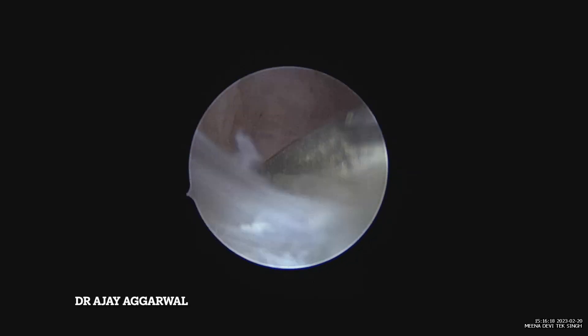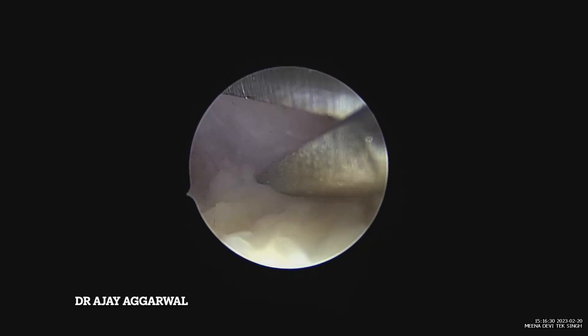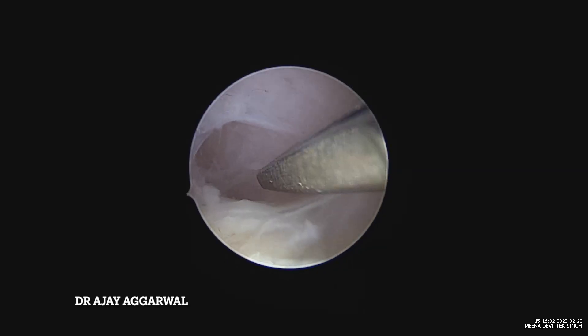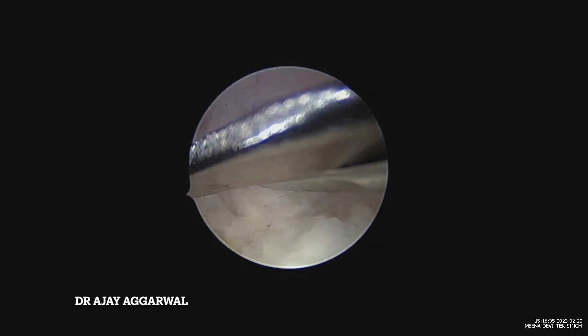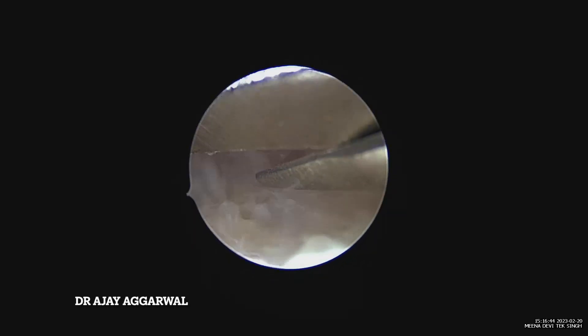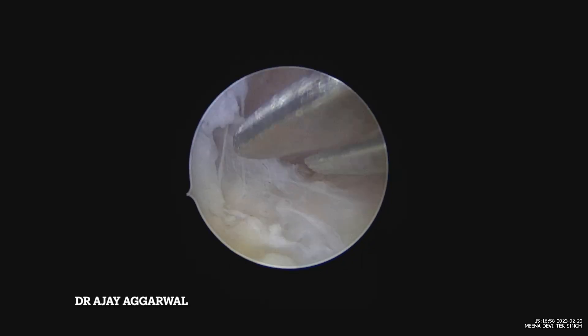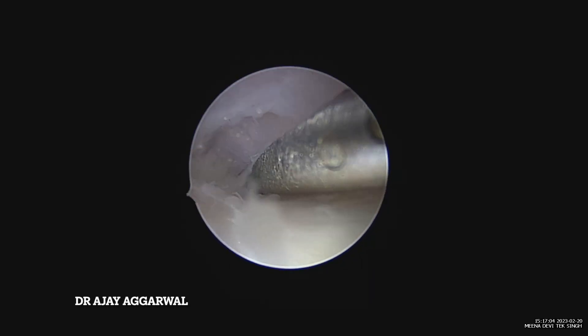The second thing I always do is go towards the lateral wall. Here you can see I am going more towards the left lateral wall, so that is my landmark. I can identify all these adhesions easily and differentiate the tissue texture between the lateral wall — which is natural and normal tissue — and the adhesions. I dissect towards the lateral wall, open the planes, and then cut.